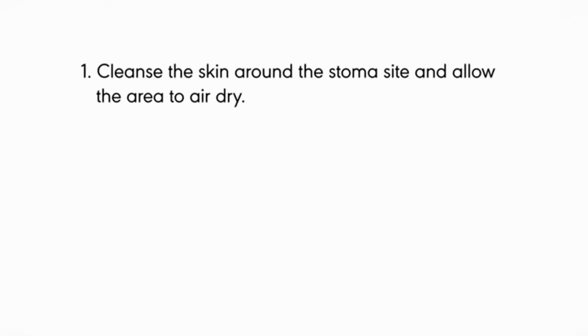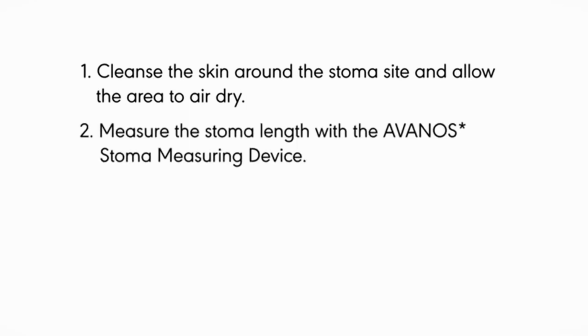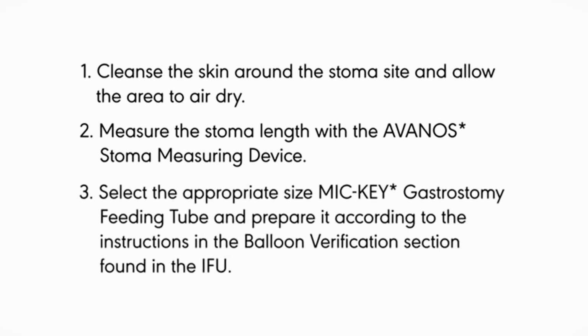Cleanse the skin around the stoma site and allow the area to air dry. Measure the stoma length with the AVANOS Stoma Measuring Device. Select the appropriate size MIC KEY gastrostomy feeding tube and prepare it according to the instructions in the balloon verification section found in the IFU.